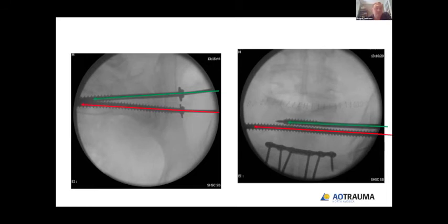And again, is that necessary? There's a lot of suggestion that maybe one screw would be enough, but with the patient's nice favorable anatomy, it made sense to me to make a stronger construct for him. Also, he's quite a large gentleman, and I never quite trust the anterior plates when the patient's obese.